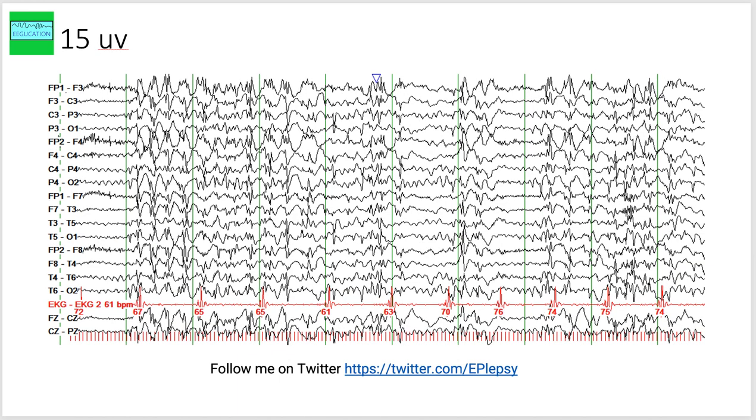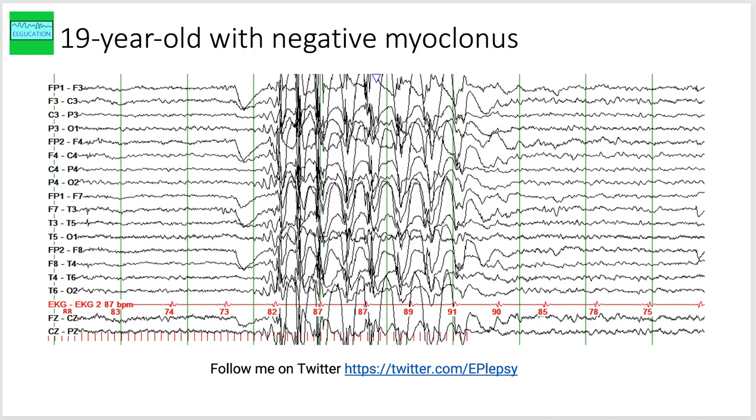This is the previous EEG at a lower gain. This is a 19-year-old with negative myoclonus.